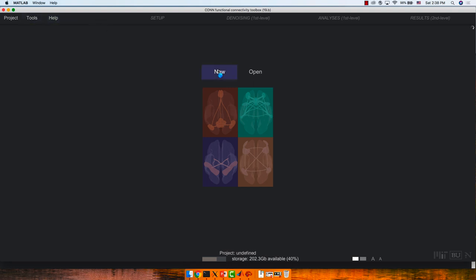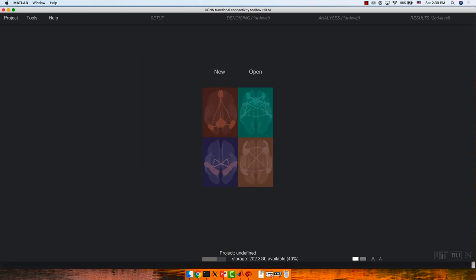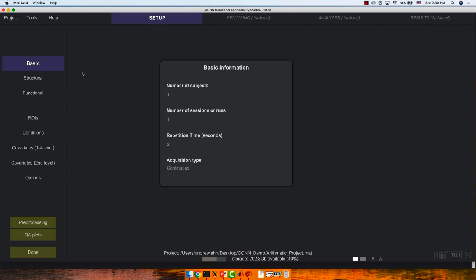Click on New — we're going to create a project file. This is a gigantic MATLAB structure file that contains fields indicating what options you set and where the data is located. Just make sure it's being saved in the ConDemo folder — I'm going to call it 'arithmetic_project'. The first field is Basic Information. We're going to be analyzing a single subject, so leave number of subjects and number of sessions at one.